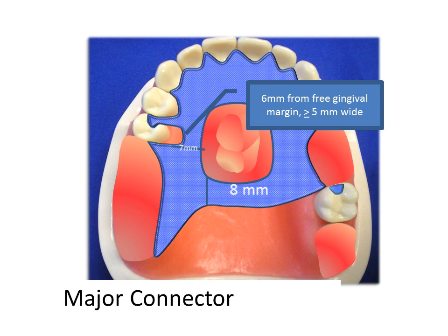connector. It is not necessary to plate the anterior teeth, but doing so will facilitate maintaining the serviceability of the partial denture in the case of unplanned tooth loss.